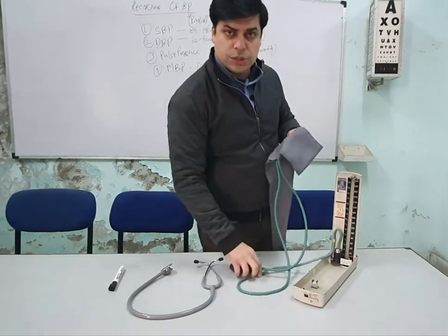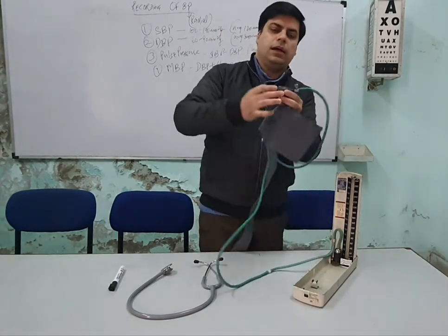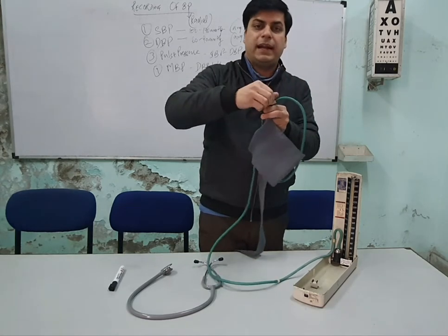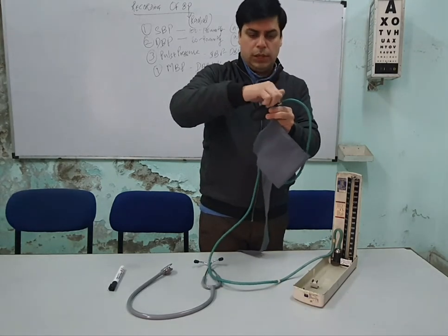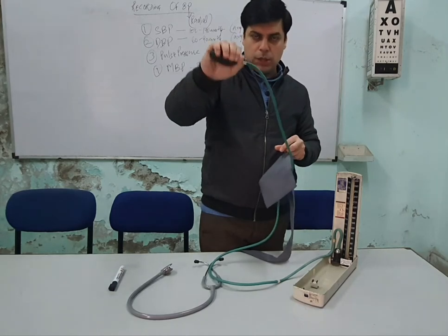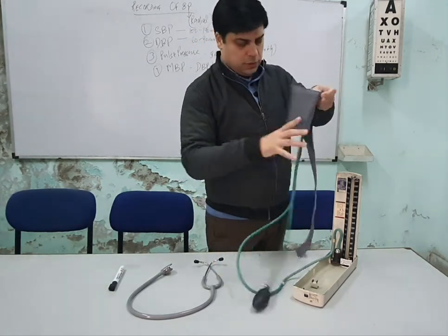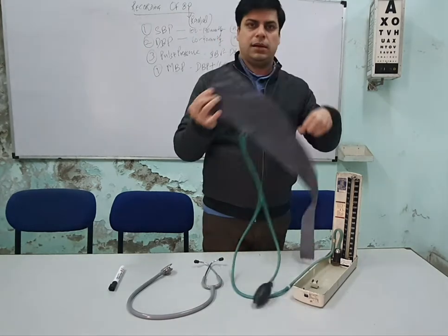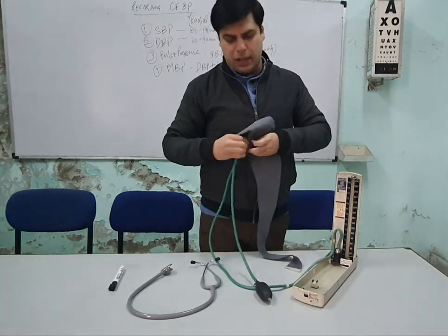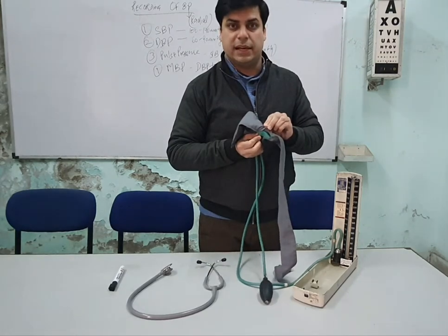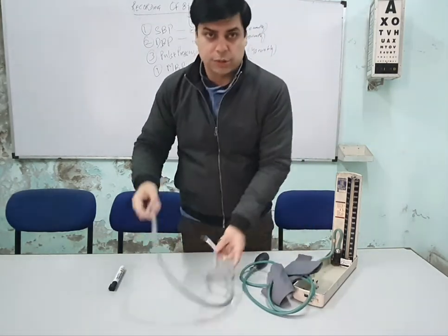Key components to note: there is a screw valve to inflate and deflate, a rubber bulb for inflation/deflation, rubber tubing, and the cloth covering the inflatable rubber bag inside. There is also a stethoscope used alongside the sphygmomanometer.